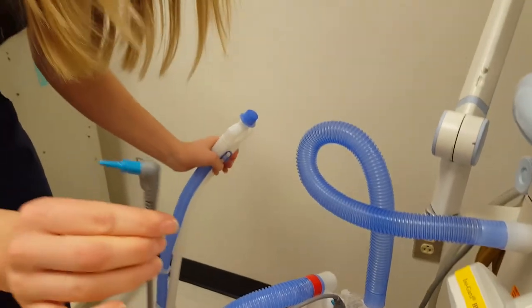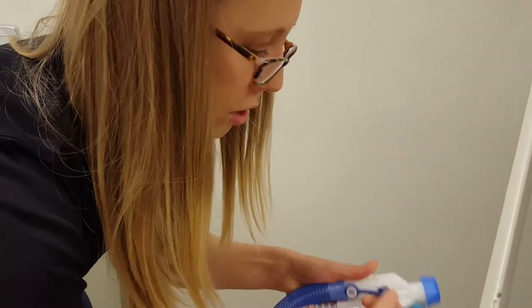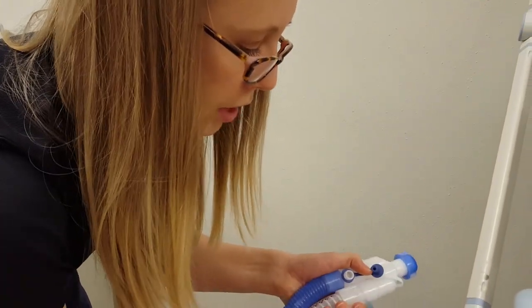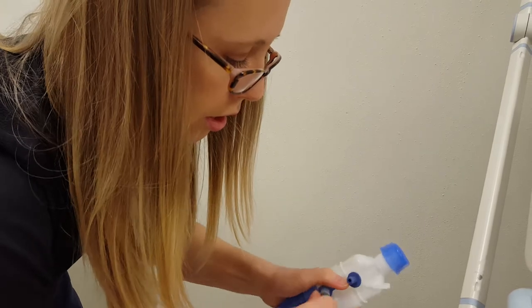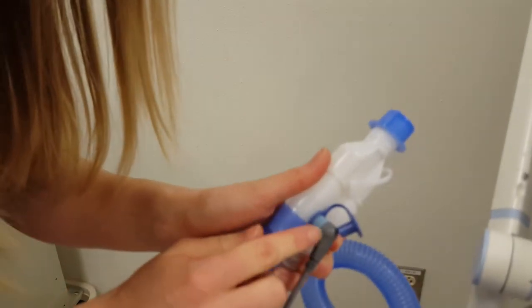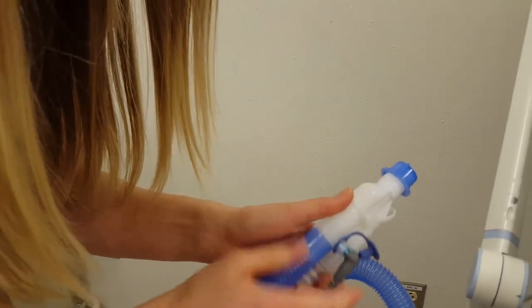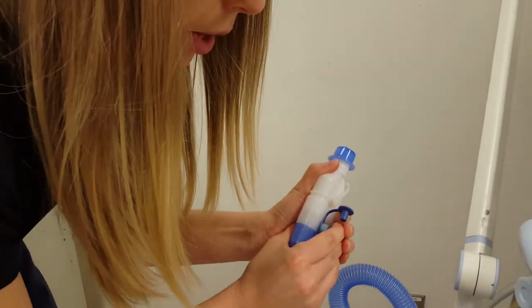The long end of the temperature probe goes up top at the patient end. There's a port — open it up and insert the probe. Again, make sure it's all the way seated in. Otherwise you'll have a leak, so don't leave it sticking out — push it all the way in.